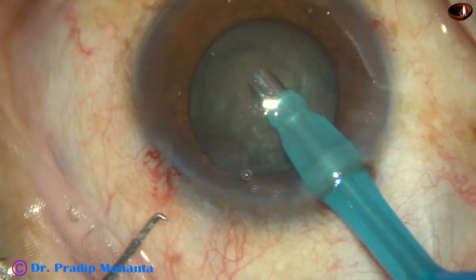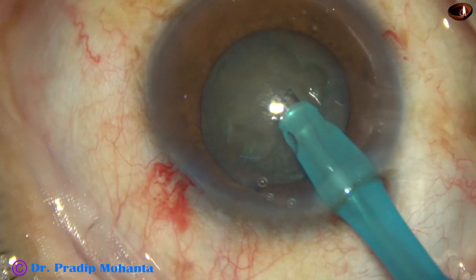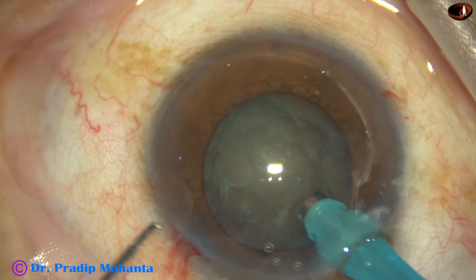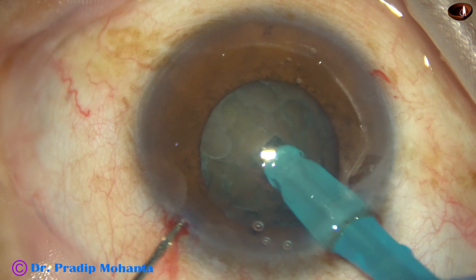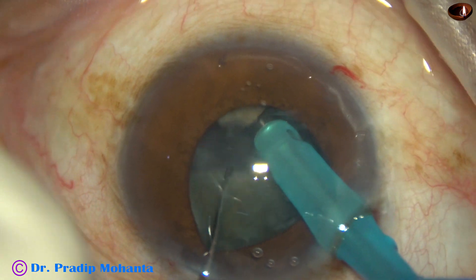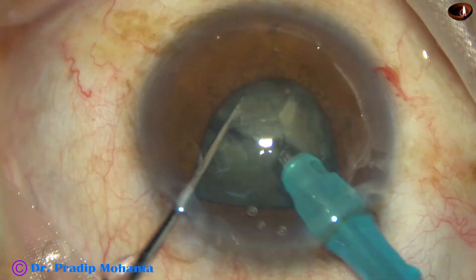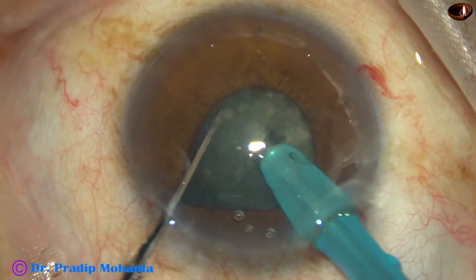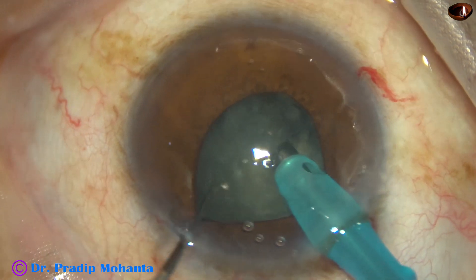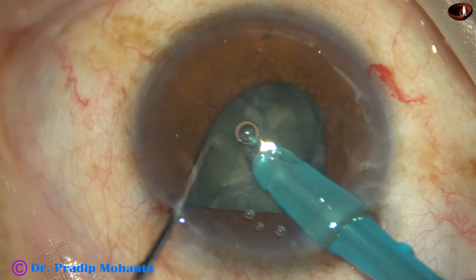As I introduce the chopper and as the fluid leaks through the side port, and as I apply vacuum, the pupil becomes small. This is the first chop, second chop, third, fourth, and fifth.